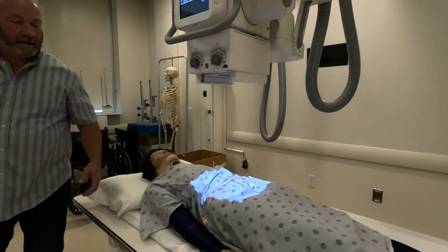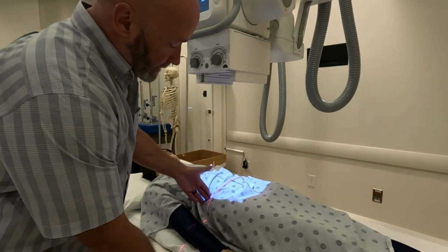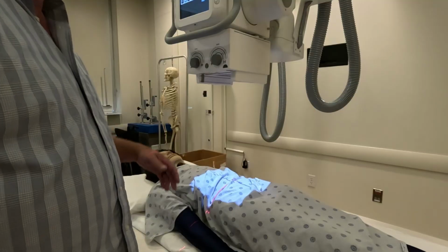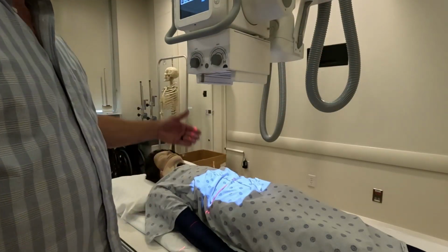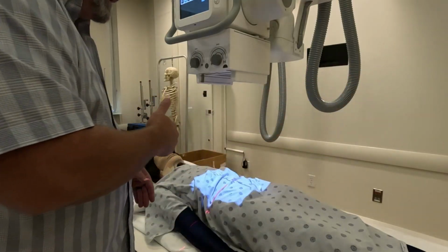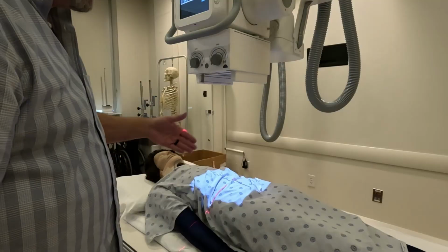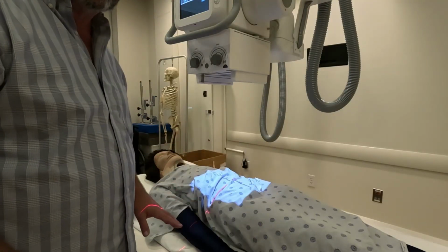So this is KUB, kidneys, ureters, and bladder. We're going to center at the iliac crest. The steps again are move the X-ray tube out of the way so the patient can get on the table. Once the patient's on the table, move the X-ray tube back, lock it in transversely, lock it in vertically, align it to the table bucky, and then move your patient throughout the light field.